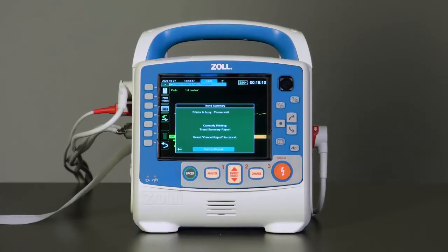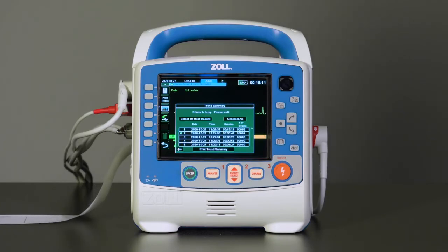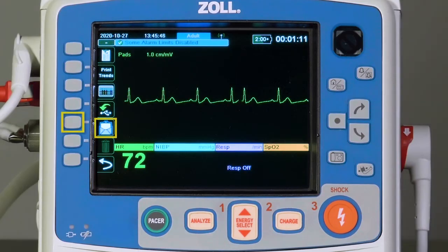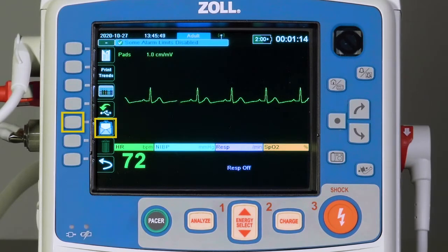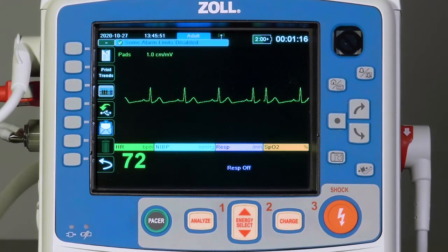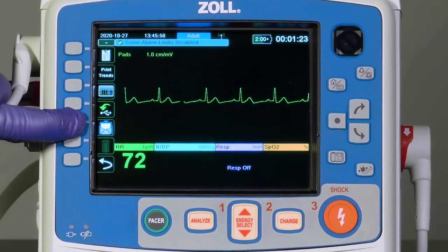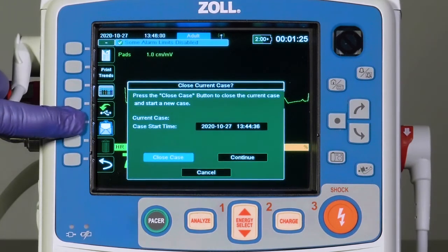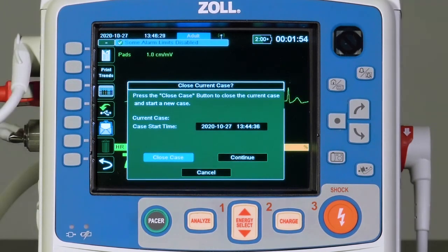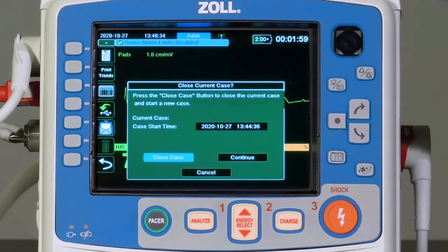Printing can be stopped at any time during the trend printout. The Case Push key is used to send cases to Zoll Online, where they can be immediately accessed through RescuNet Case Review for QA or QI purposes, or imported into many ePCR platforms. To push a case, follow the blue highlighted options and select Close Case.